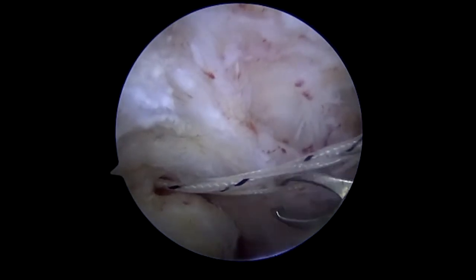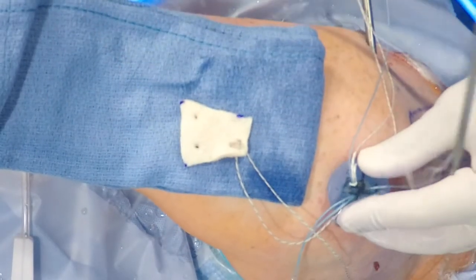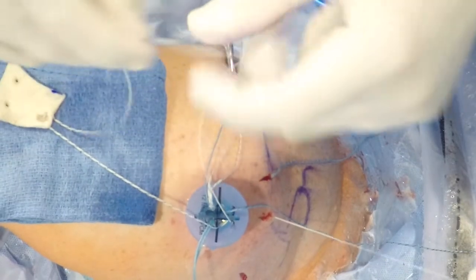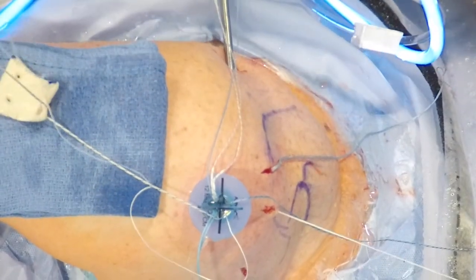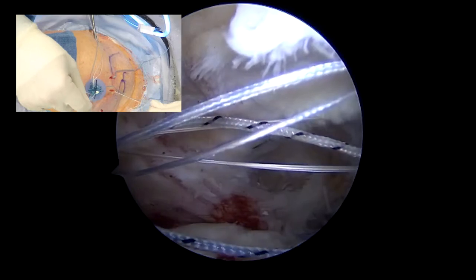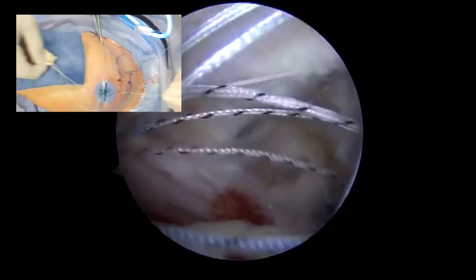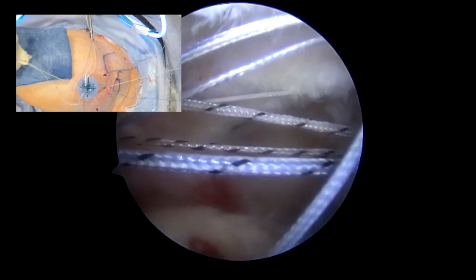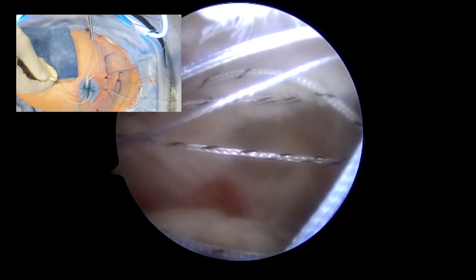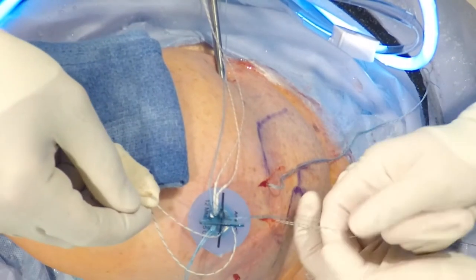As mentioned, the suture management here is critical. We are loading the loop on the shuttling stitch, which we will now be pulling from the most medial portal as we pull. At this point there's always a bit of resistance because the suture is being passed through.